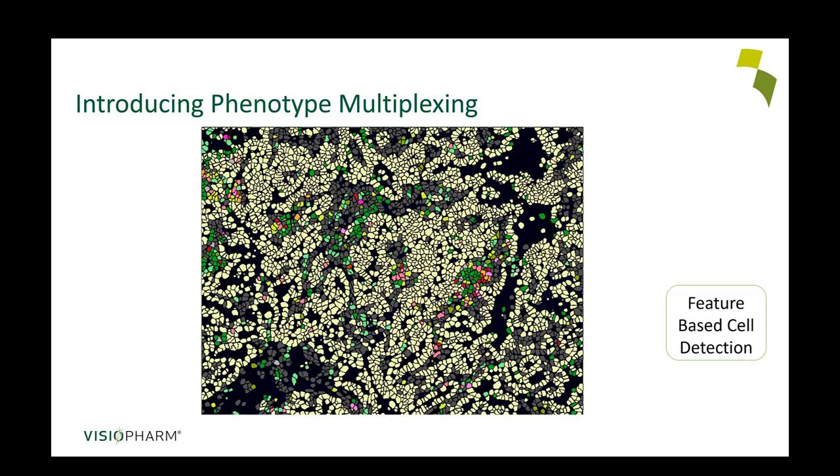Once phenotyped, the image takes the appearance of something quite different from the cell segmentation, where here in yellow, we can actually see where the tumor is annotated. The multicolored cells are actually immunoinfiltrates based on the phenotyping. And then there's other types of cells located within the tissue that didn't meet certain selection criteria, and those are just marked gray. How we get to this through that last interface is very straightforward.